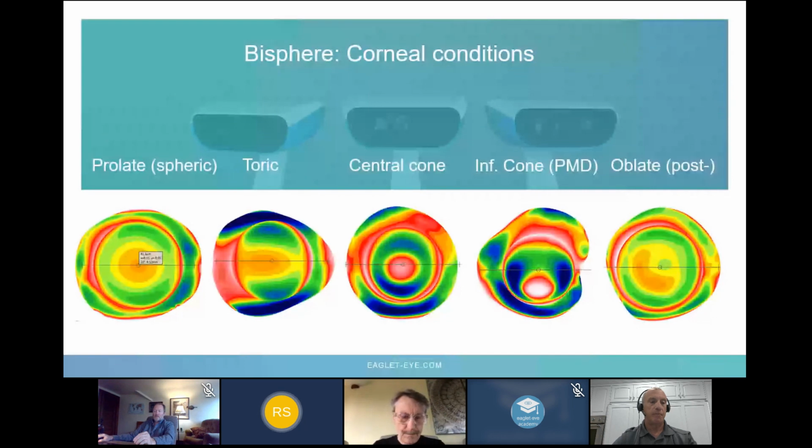And meanwhile, I have the time to read more questions. Chian's question, what scleral lens design would you both usually fit? Yeah, I'm writing the answer, guys. Sorry, what did you say, Brian? I'm typing the answer in chat, so I'm going to put it in. Okay, perfect, yeah.